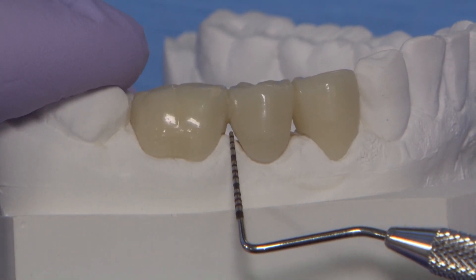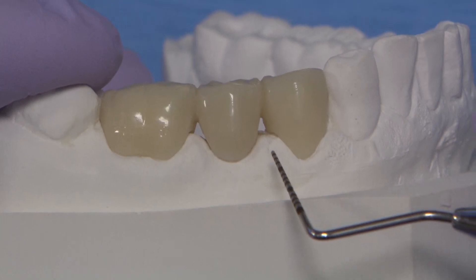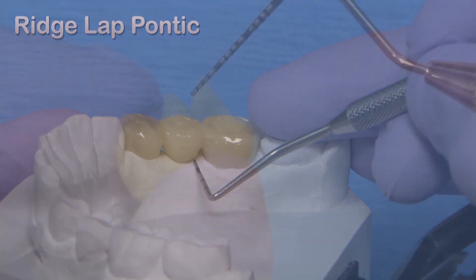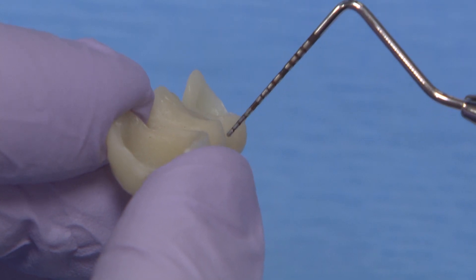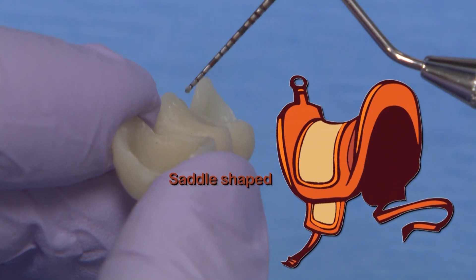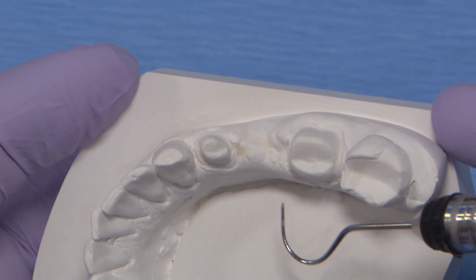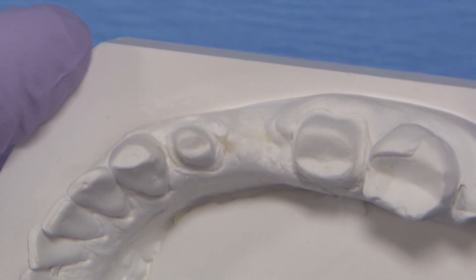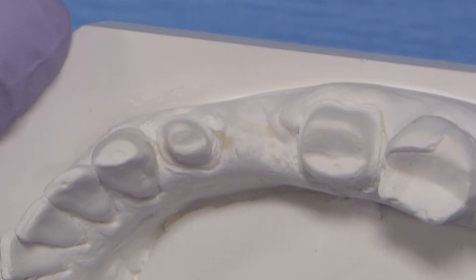Take for instance the pontic design on this 3-unit biotemp bridge. When I turn it around you can see the appearance of a ridge lap pontic design. It's also called a saddle ridge lap because it looks like a riding saddle that's worn over the back of a horse. It's a fairly aesthetic design from any angle, but its major flaw is its lack of cleansability, and it often results in irritated tissue.